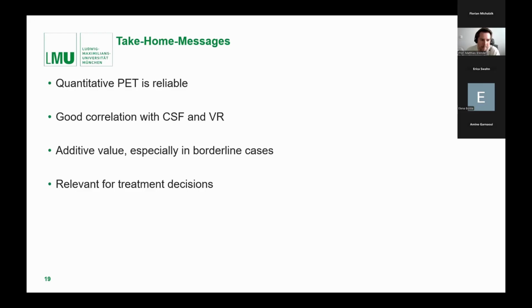And I think also in cases that have only low amyloid, although they are positive, it will hopefully guide us towards good decisions, because what we should consider is co-pathology. And I think cases that have already cognitive impairment but very low amyloid, these are also the cases where you should go for more clarification in terms of co-pathology.